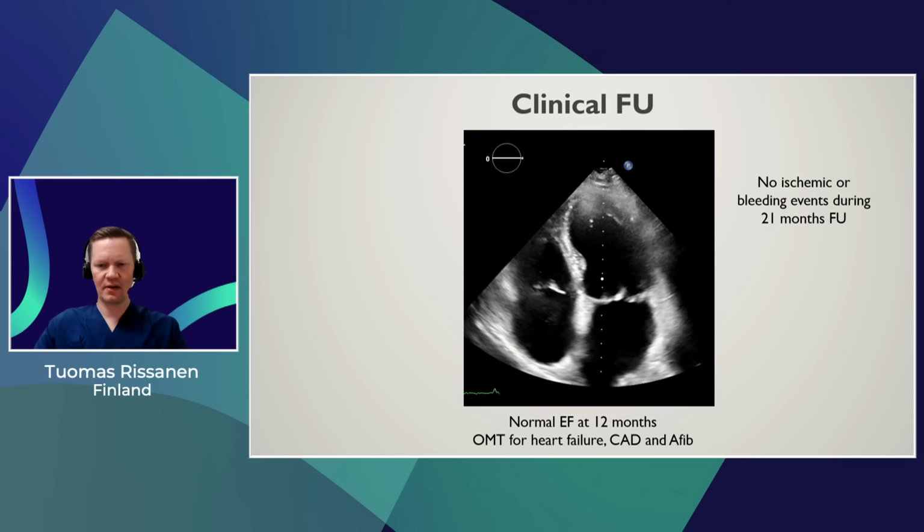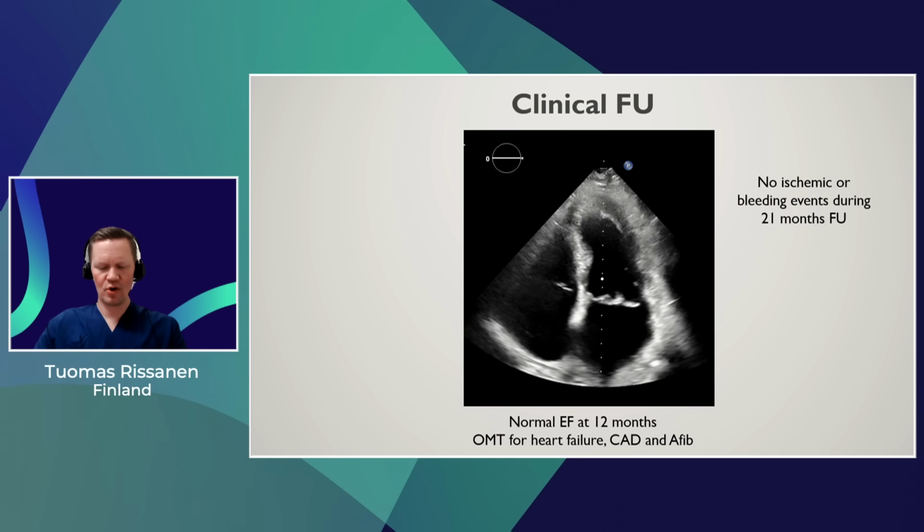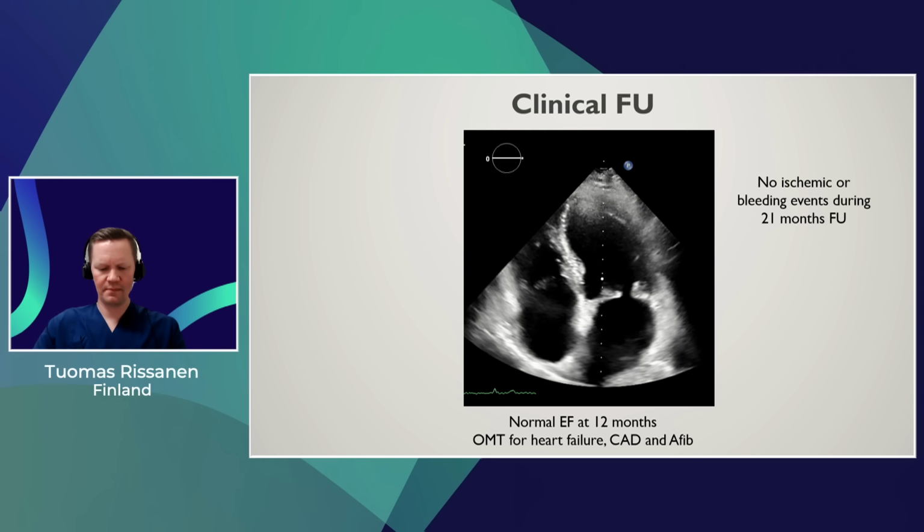We have followed these patients already 21 months. There are no ischemic or bleeding events, and the ejection fraction was normalized at 1 year.